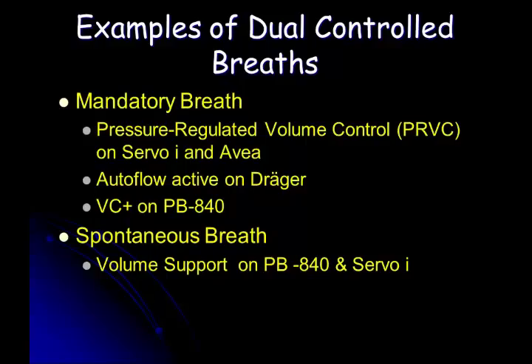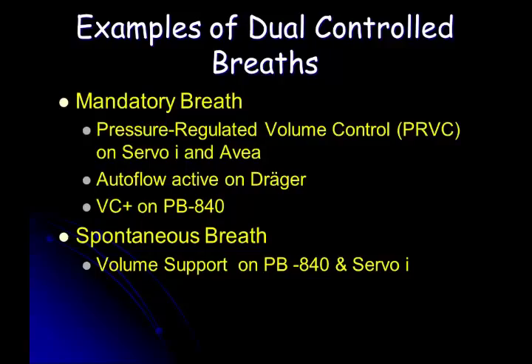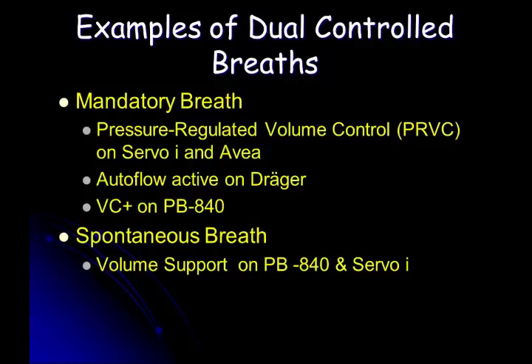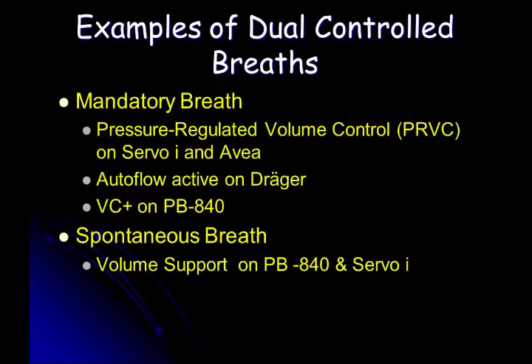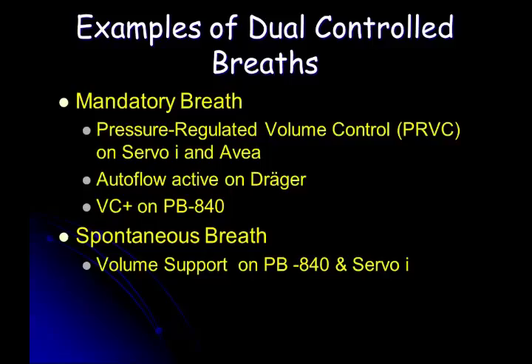Any ventilator in the face of a pneumothorax is going to be a problem, regardless of how you have it, right? Untreated pneumothoraces don't do well with mechanical ventilation. But when it's trying to reach a volume, it just keeps increasing pressure. It just worsens the pneumothorax, yeah. But that is really true on volume-oriented ventilation or on pressure-oriented ventilation. So don't worry about that one.